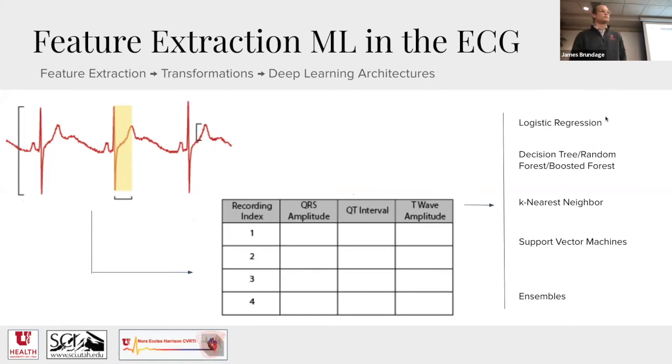Awesome. Yeah. Is this feature extraction an automated thing? So there, yeah, therein lies the rub, right? Yes, to an extent. The cardiac electrophysiology group has actually developed some software called Pfeiffer that does some of this feature extraction. However, doing it at scale on tens of thousands or hundreds of thousands or eventually millions of ECGs is not necessarily easy, and ensuring the accuracy. So yes, to an extent, but that's still an open area of work to improve that process. Other questions on this?